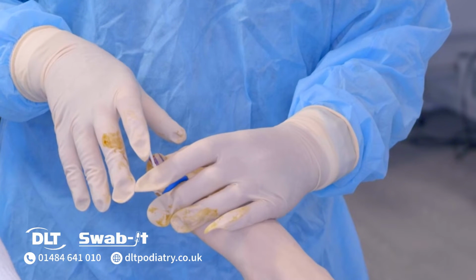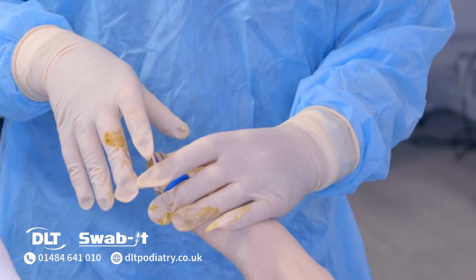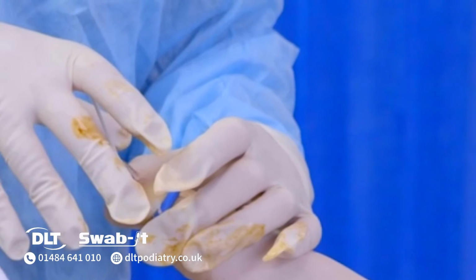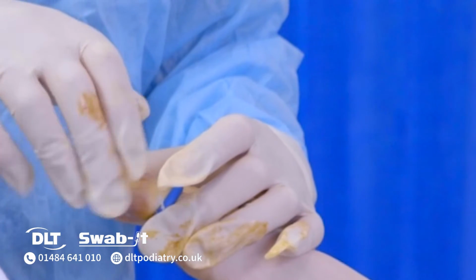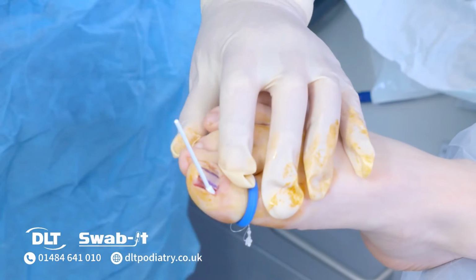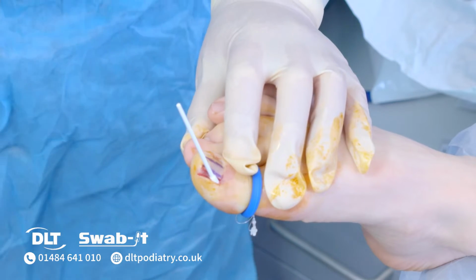Not removing enough nail will mean that the procedure might need to be done again in 3 or 4 years' time. I'll go into how to use the Swab-It with the total procedure, but you can actually see there that the bud size for me isn't an issue.